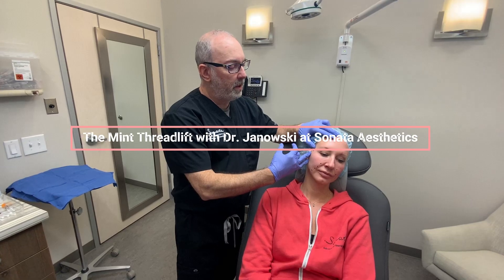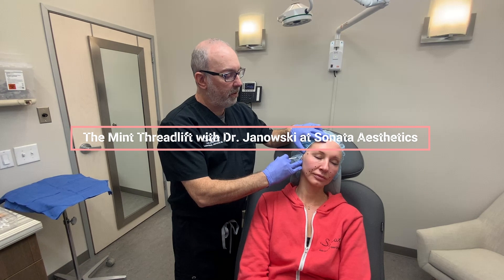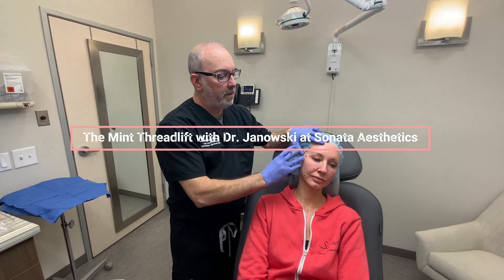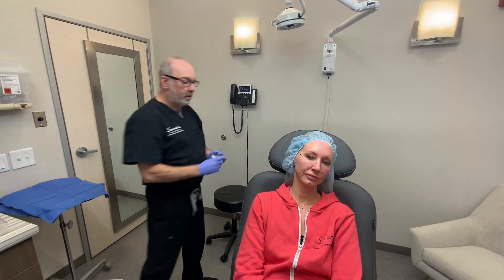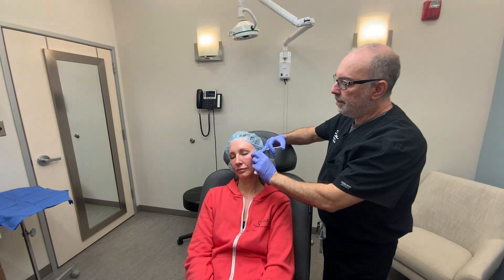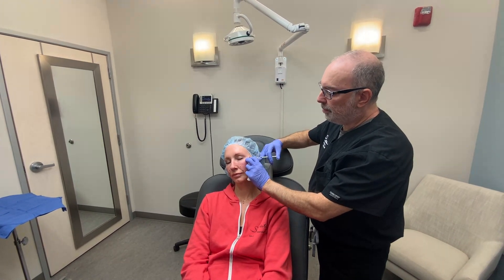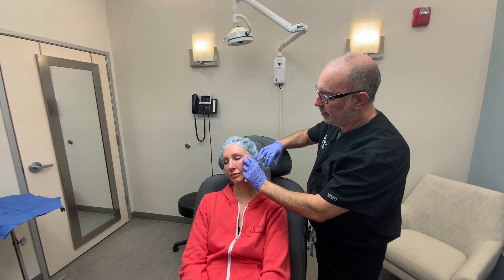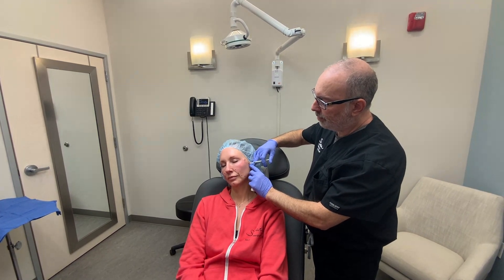We're going to place a little bit of numbing in our two entry points before we do some numbing underneath the skin. We're using our typical 1% lidocaine with epi, and we're just pre-numbing these areas a little bit here, and we're going to move this one a little bit further back.